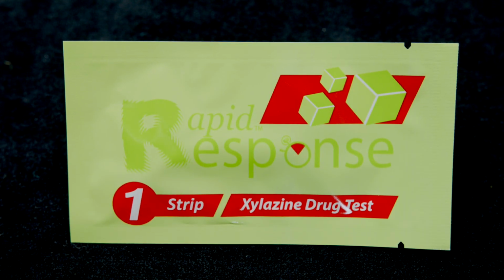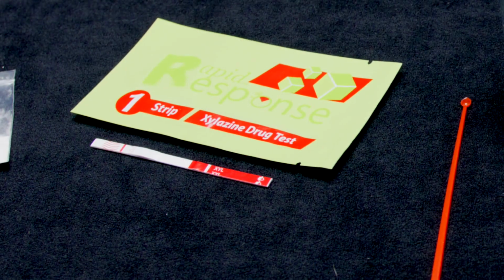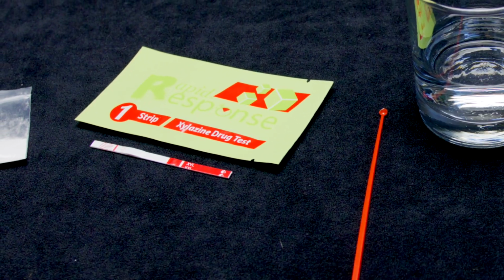Xylazine test strips are an easy-to-use screening tool that can be used to test street drugs. The strips can identify if the drug contains xylazine. However, xylazine test strips cannot identify how much xylazine there is or how strong it is. Checking strips can alert you as to whether the drug contains xylazine, a leading cause of fatal overdoses. When checking for xylazine, make sure you use a test strip that says xylazine on the packet.